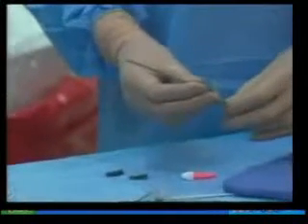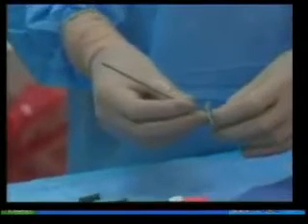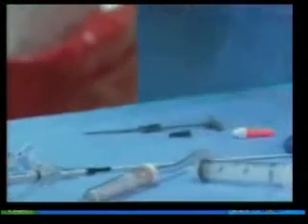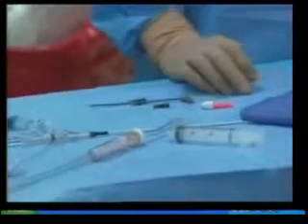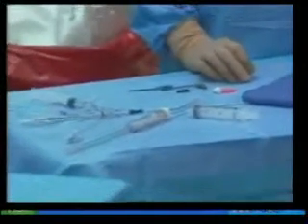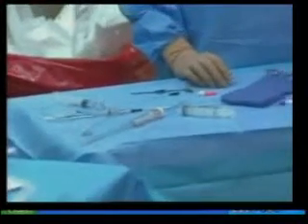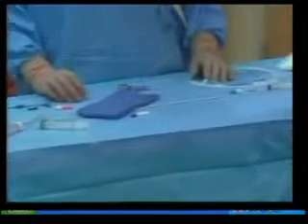And we also have a balloon here that we're going to use to occlude the external carotid artery while we're doing this. So there'll be a balloon inflated in the external carotid and a balloon inflated in the common carotid, and that is going to allow us to have a flow reversal. Right. And Chris, Ty or Steve, do you know from the cerebral angiogram, is this an isolated hemisphere or not? We can show you those images, and this is not an isolated hemisphere.